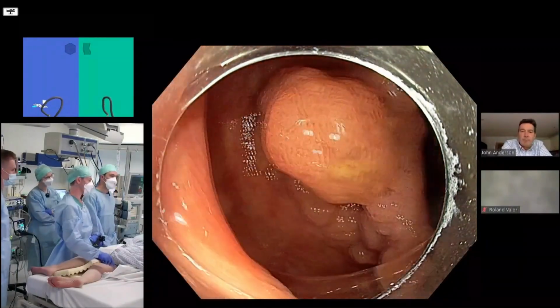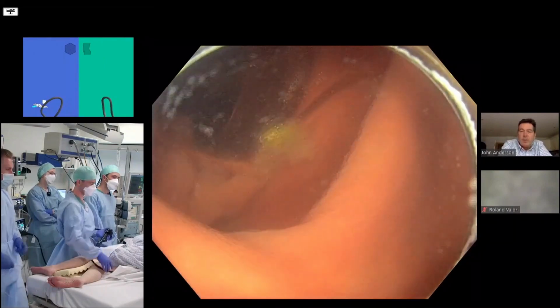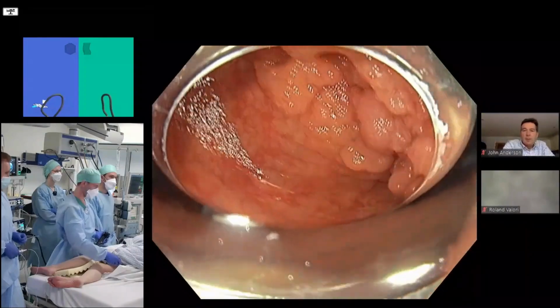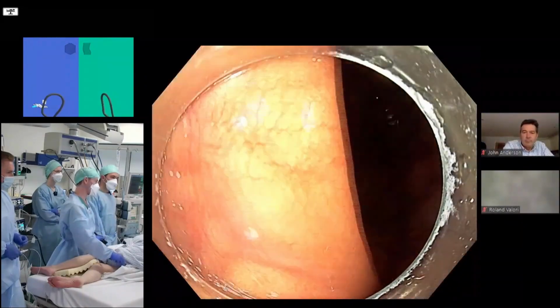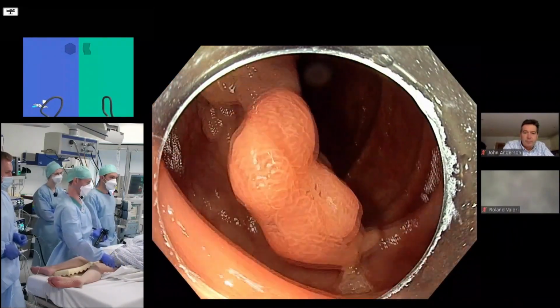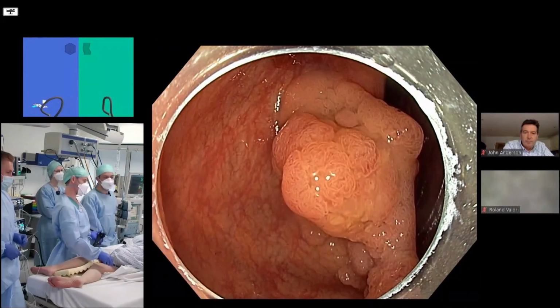All right. So in terms of plans, Anna, what are you thinking? The Snare Master Stiffer, but I'll use Captivate. So I would try to firstly do the more difficult parts. I don't think you need to worry about that. I would start in a place where you feel comfortable and work into the plane. So where's an easy place here? Maybe on top. Exactly, right on top.